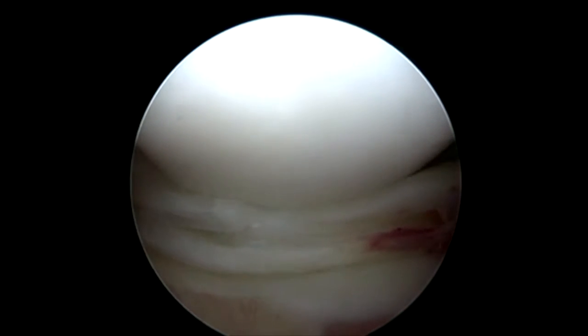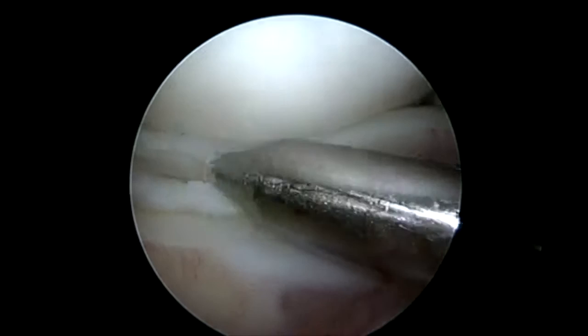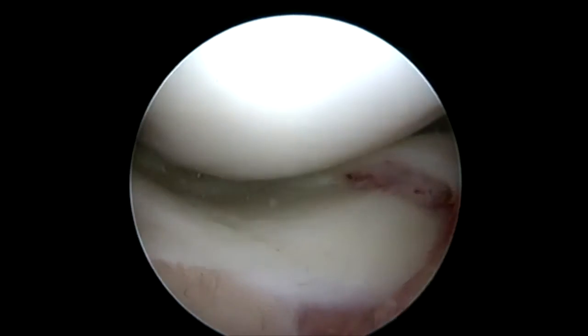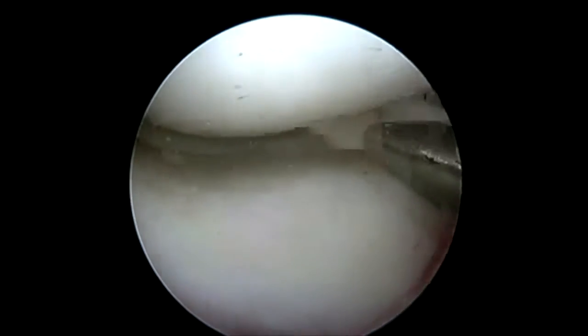We'll go ahead and bring in our probe and reduce this. In this case we're just going to use the blunt end of the obturator to flip this meniscus back over. Sometimes it requires a nerve hook probe in order to get it to turn back as well.